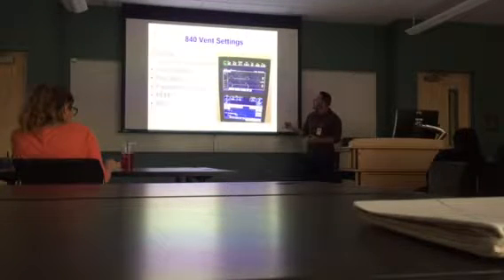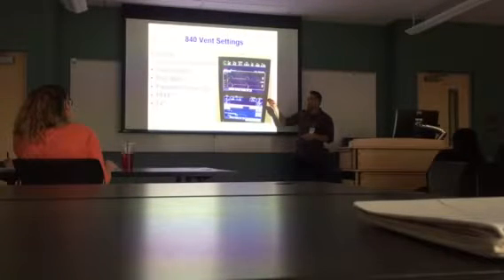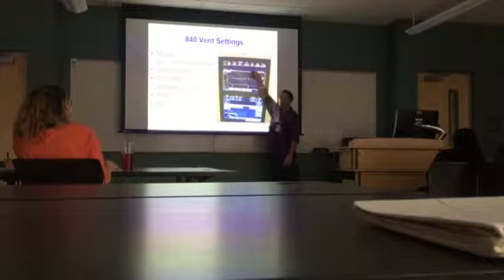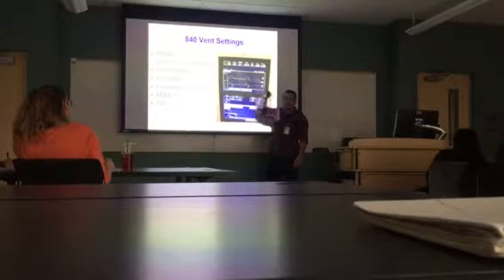So for example, here I put an assist control rate of 10, and the patient is doing a rate of 10. Thus, the patient is getting controlled breaths. If I put 10 here, and the patient has 20, then 10 out of those 20 breaths are going to be controlled, and the other 10 are going to be an A for assisted.